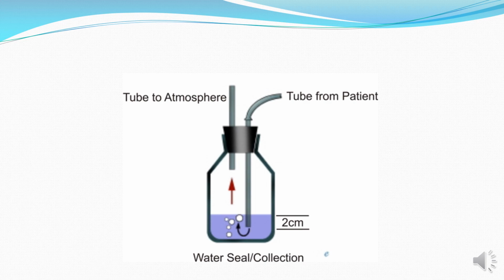Okay. This is a single bottle, and this one is usually indicated if you are draining only air. You cannot have a single bottle system if you are draining both blood and anything else. So no fluids should be drained under one single bottle. Okay, so if it's a single bottle or one bottle system, it's only indicated for what? For air. In short, it's only indicated for pneumothorax.